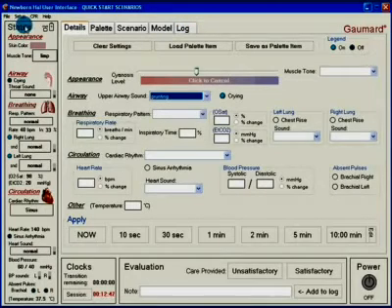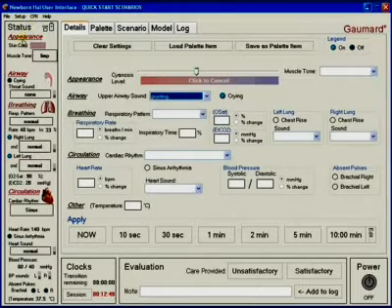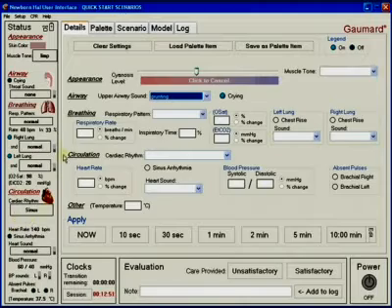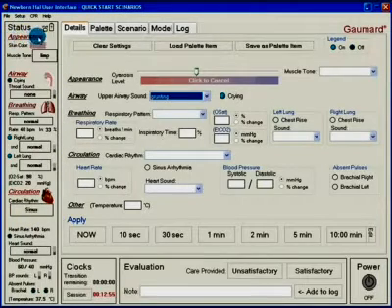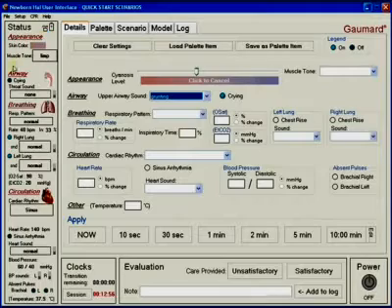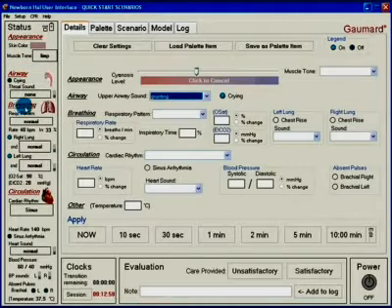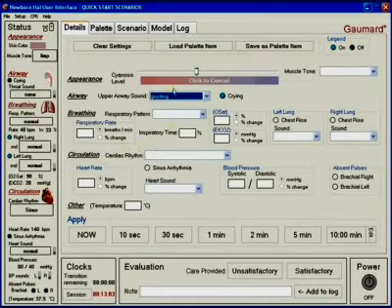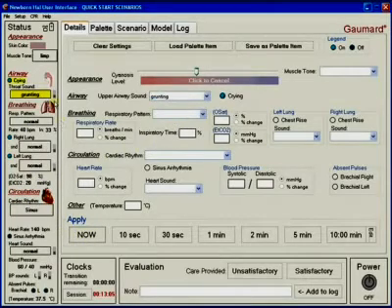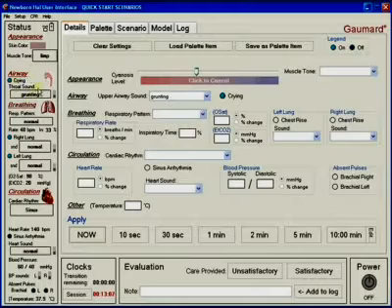The status panel shows the user the current vital state being transmitted to the simulator by the controlling software. For visual clarity, the status window is broken up into relevant sections. Additionally, when any parameter is updated, the corresponding value is highlighted in the status viewer.